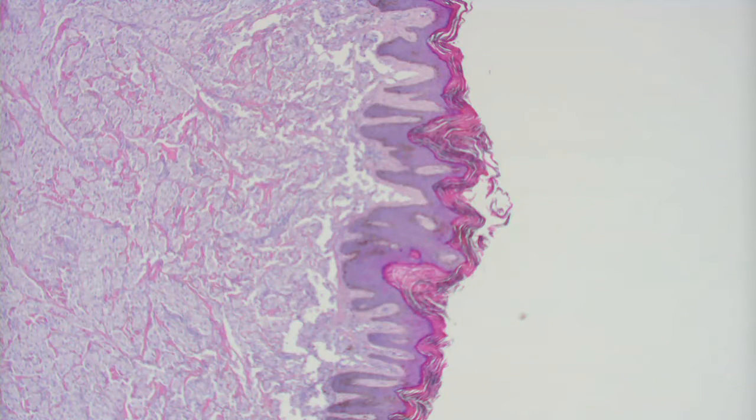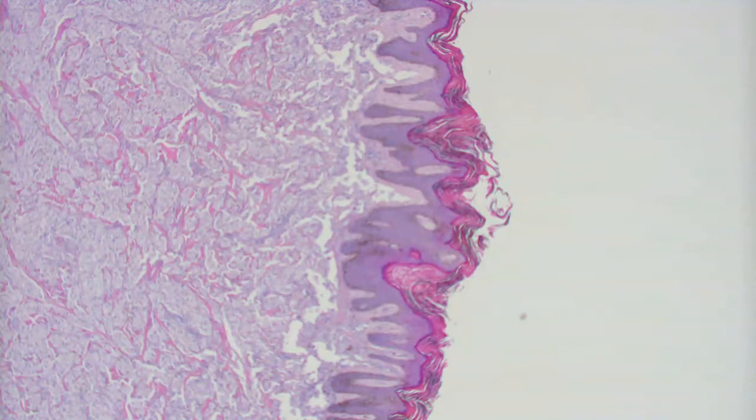A picture of that here. So that's this guy's tongue on the right. Notice he's an African American man. That's actually a fairly common neoplasm to develop in dark-skinned patients, especially African Americans. And so you don't want to call it a squamous cell on somebody's tongue, and then they have to wipe out their tongue and all that stuff. That could be a big problem. So just remember that you can get pseudoepitheliomatous hyperplasia in these lesions. We used to think these were muscle tumors. They used to be called myoblastomas. So myoblastomas, we now know that they're not muscle in origin.